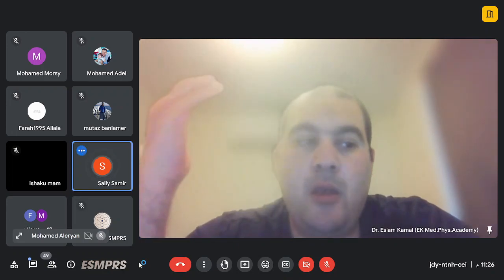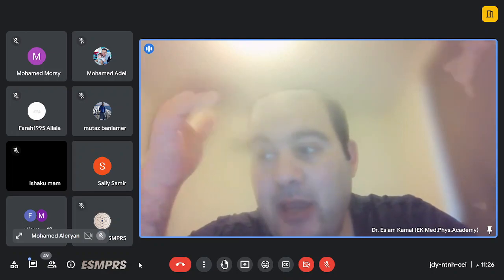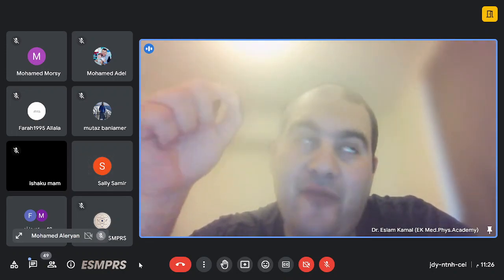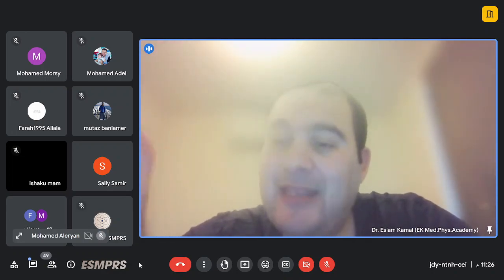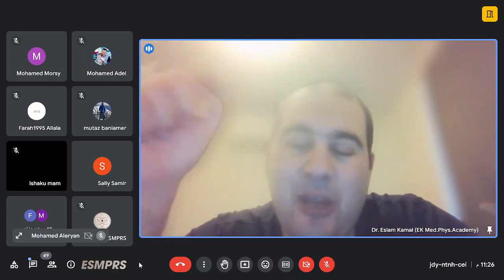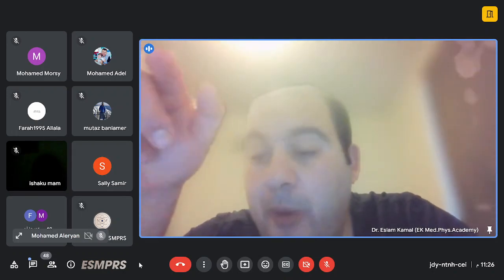تمام دكتور؟ طيب أفضل تيشو إيكويفالنت، يعني ممكن النانو بارتكل نذوبها في الميه، لو بتذوب في الميه ممكن أستخدم الميه كتيشو إيكويفالنت. خد بالك، لو الميه هتطلع في T1 دارك، فالنانو كونتراست المفروض لو هو هيطلع في T1، لو هو عمل add signal أو add brightness، هيديك برايت فيظهر معاك. لو أنا دلوقتي حطيت النانو بارتكل بتاعي جوه الميه المفروض يديني برايت سيجنال، ده لو النانو بارتكل بتاع حضرتك شغال.